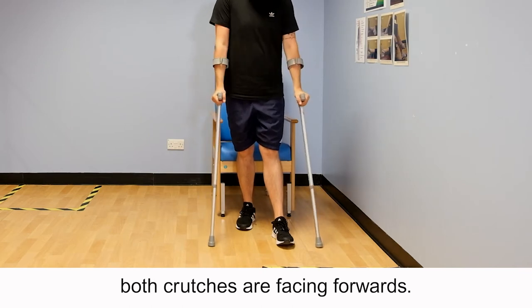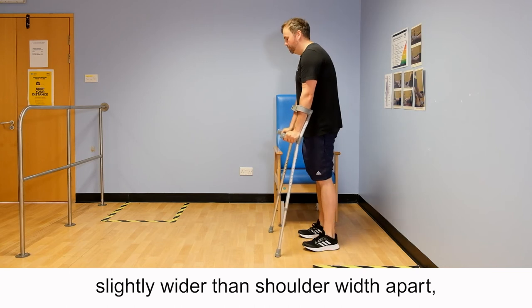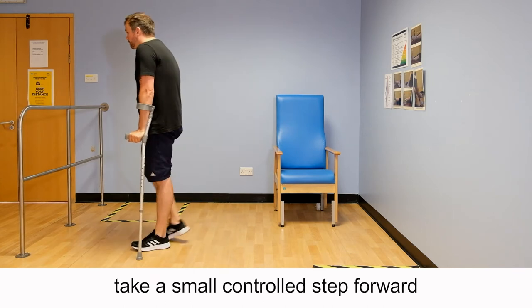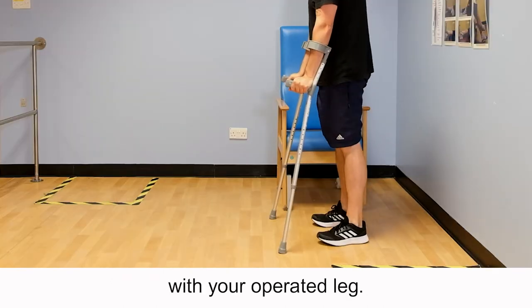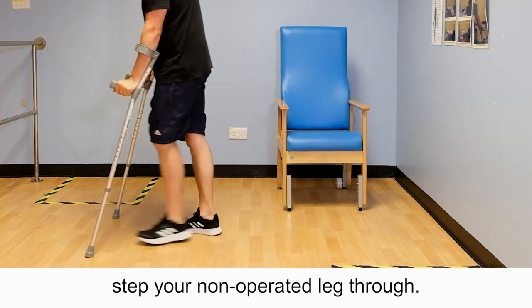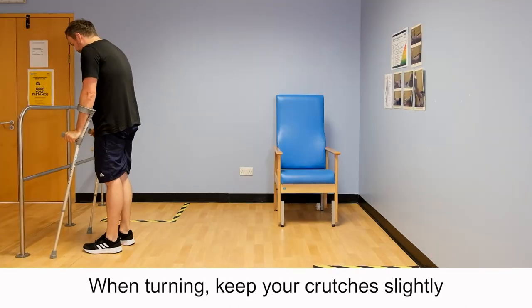Step both crutches forward, slightly wider than shoulder width apart, taking some weight through both crutches. Take a small controlled step forward with your operated leg, then step your non-operated leg through. Use a slow, steady, controlled pace.